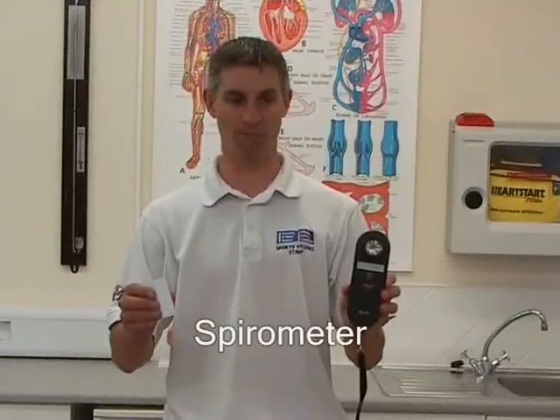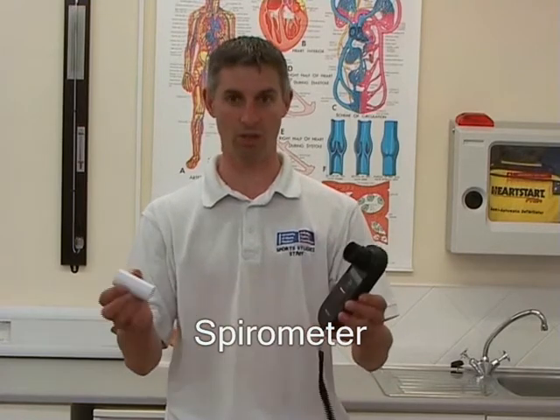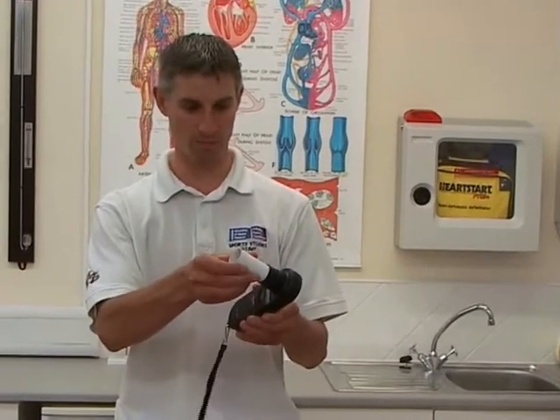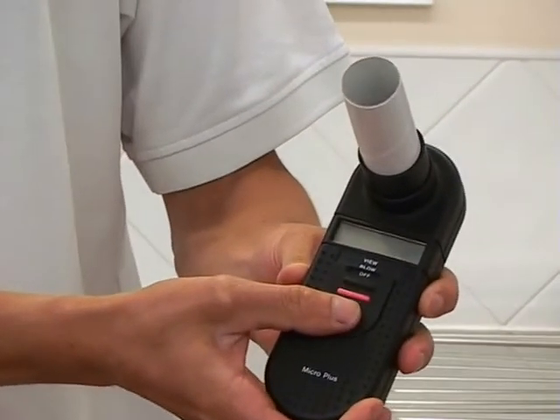This is called a spirometer. It's a small handheld device which has a flow meter inside. It simply collects data by inserting a cardboard tube. The operator then pushes the selection button up to blow.